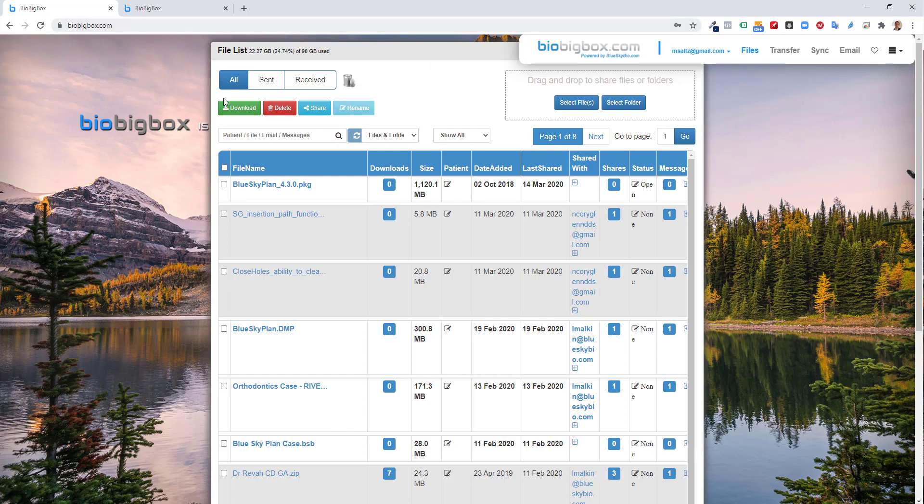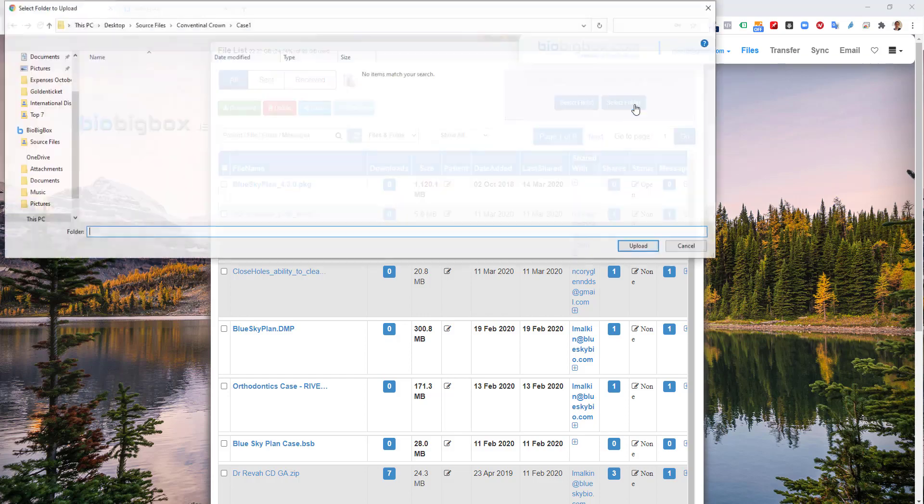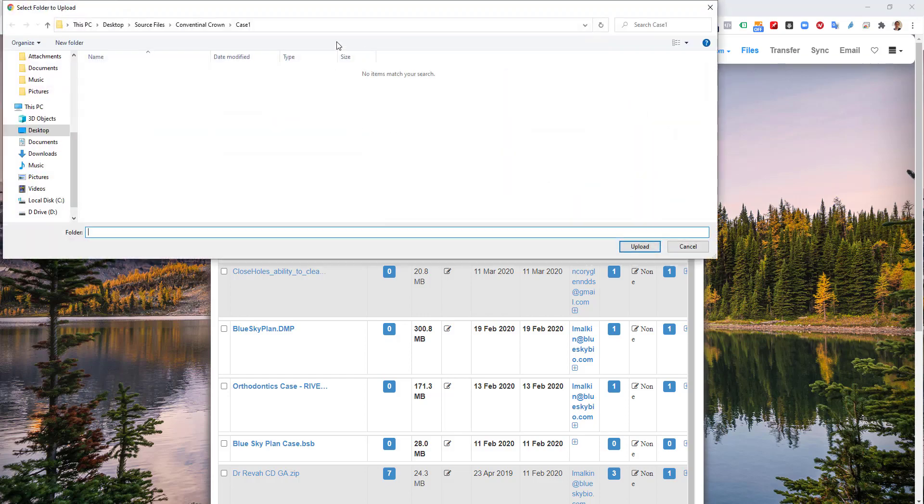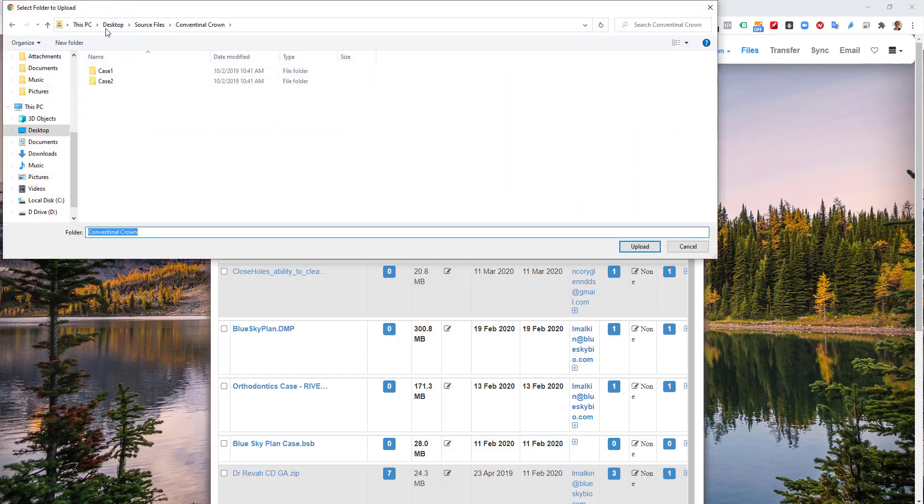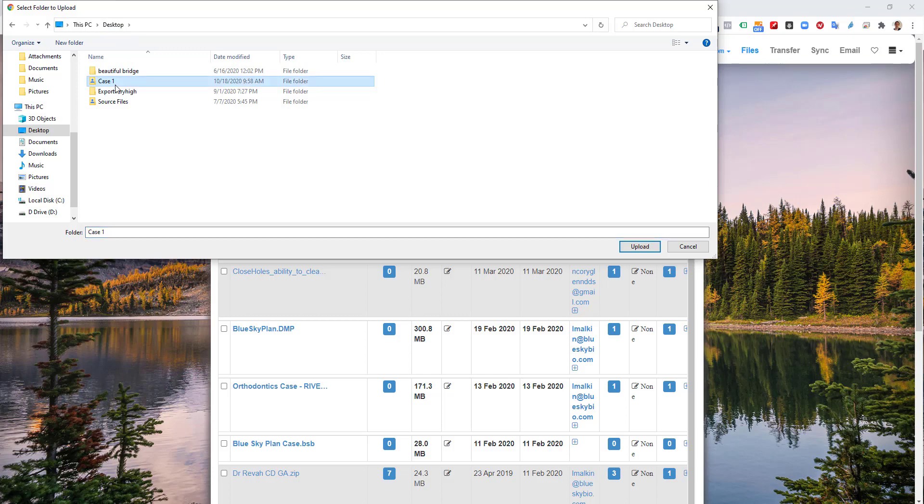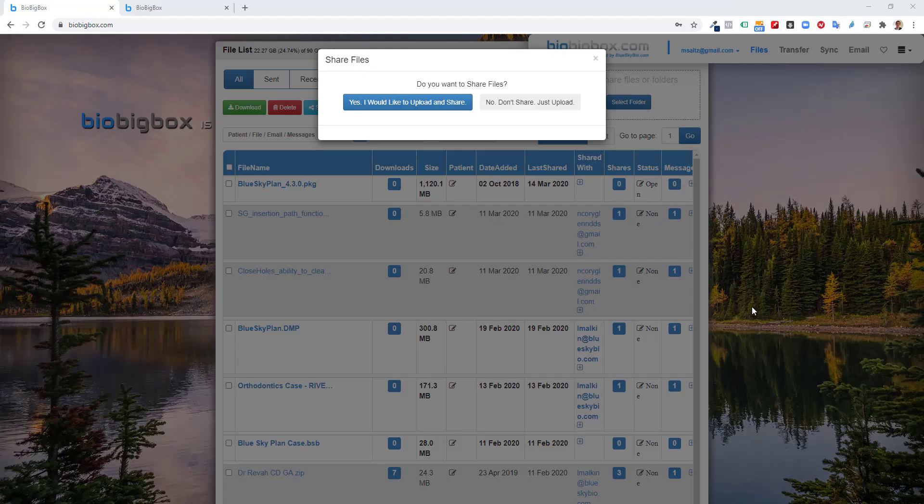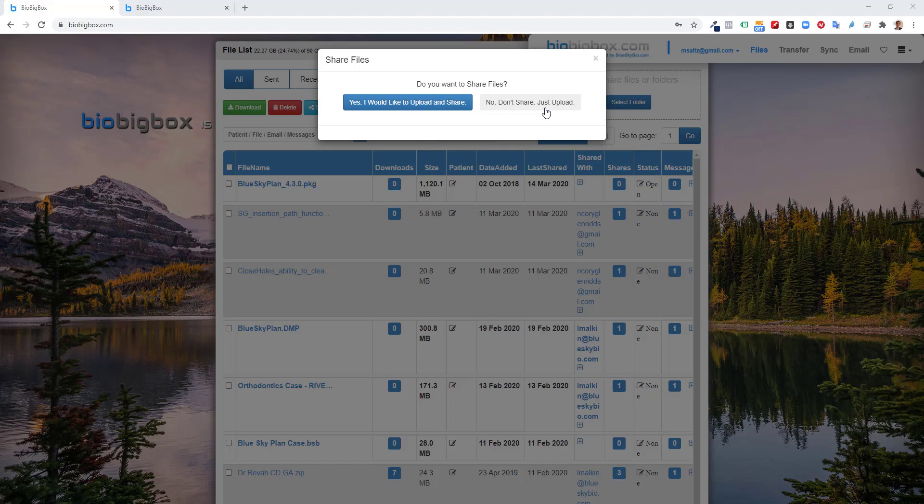I go to my bio big box account. I'm going to select the folder. I'm going to select the folder to upload and everything inside of it. So I click select folder. I click my case one folder that has those files in it. Now, as soon as I click upload, I have two options, upload and share, or don't share, just upload. So here I'm going to click upload and share.